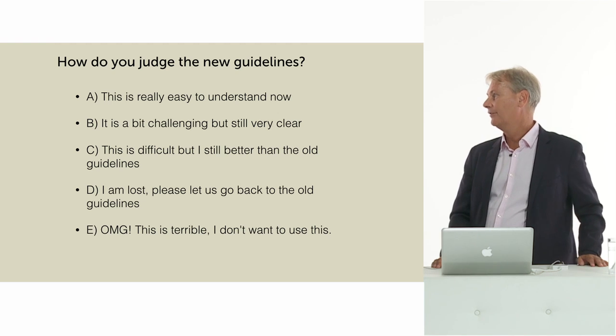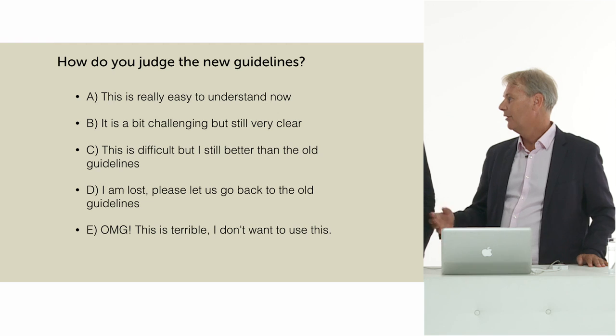Coming back to the question of complexity or not complex, how would you see this? I think it's not that complex as it looks on a first view, especially if you decide for patients with reduced ejection fraction, you can make 3 groups, and then you can go ahead with the average E/e prime, LA volume, and TR velocity. So it's pretty much the same, just the inflow pattern over all this. Okay. It's maybe not that difficult, but let's take a chance while people are voting to answer a question.